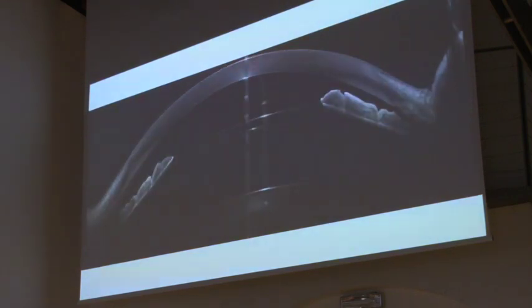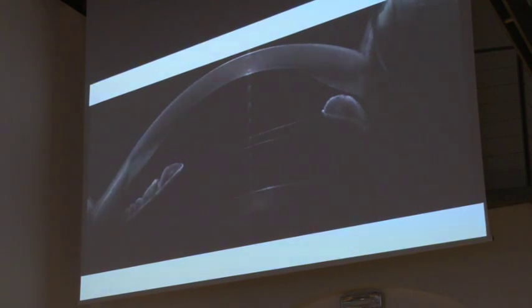But sometimes we get results like this, which is, of course, as you can see, a very high vaulting after surgery. In this case, we waited 1 week more, and the result was this. So, of course, we decided to remove the ICL.